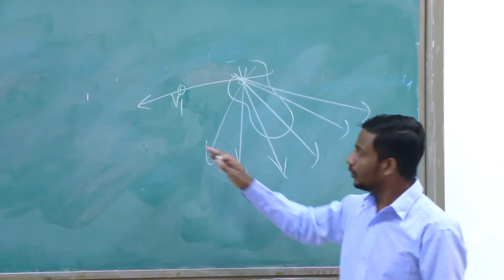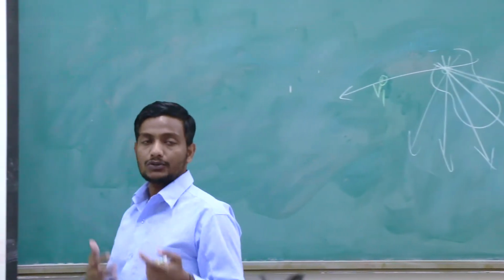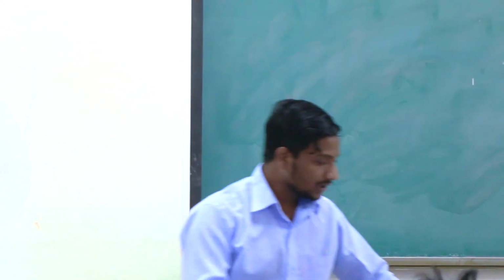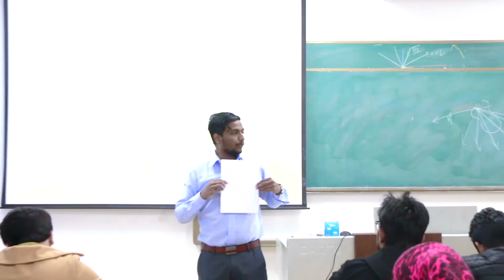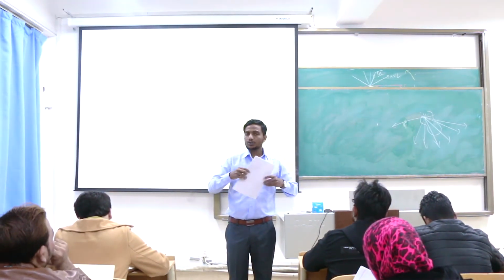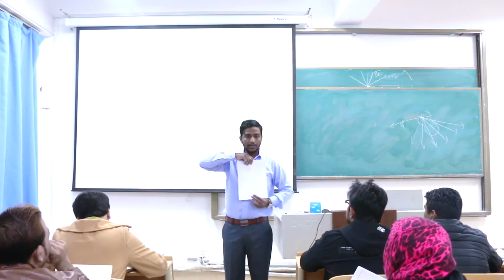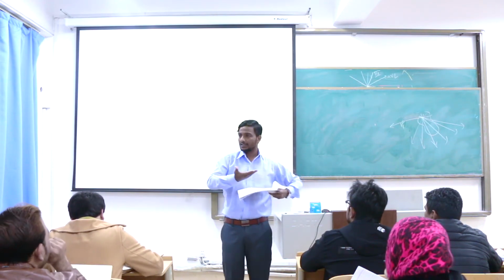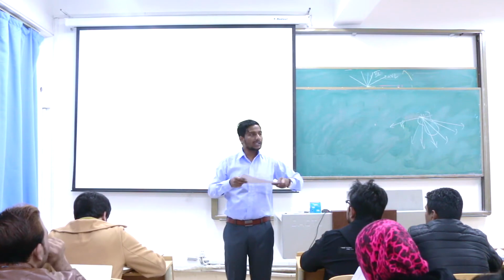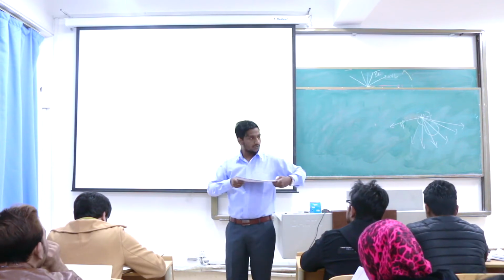Just one idea, right? So these are the different axes of our chest electrodes, and this will give rise to the leads. We call them chest leads. There is a huge difference. The chest electrodes are not going to look at our heart in a frontal plane. Rather, they are going to look at our heart in the horizontal plane, the transverse plane. It means they are looking at your heart by cross-sectioning it. Are you getting an idea? They are working in such a way that it seems the heart has been dissected in cross-section, and they are looking at this film.